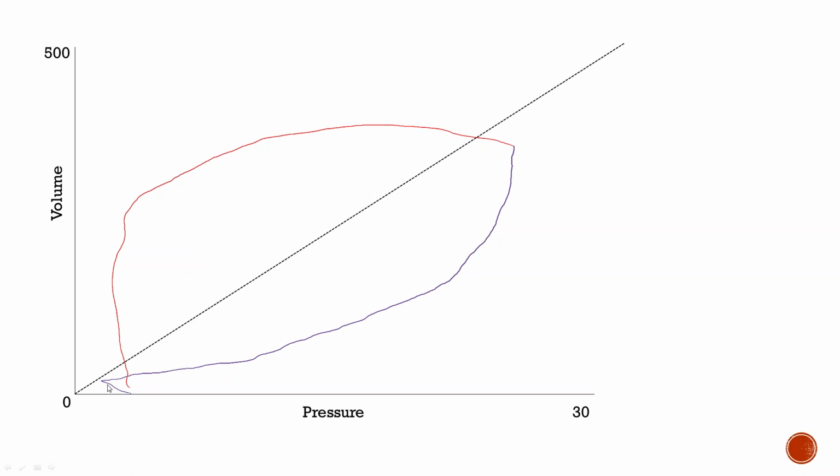And this negative pressure inflection, on the inspiratory limb, is actually the beginning of a patient-triggered breath. The ventilator will sense that negative inflection and then give this flow or pressure to give the patient the breath. So that fishtail you'll see in a patient that triggers a breath, versus the previous ones which were passive breaths.